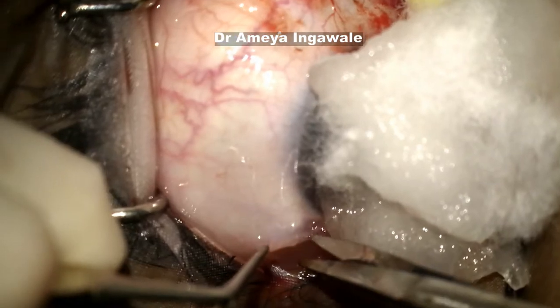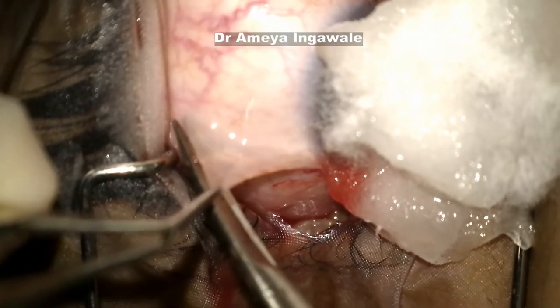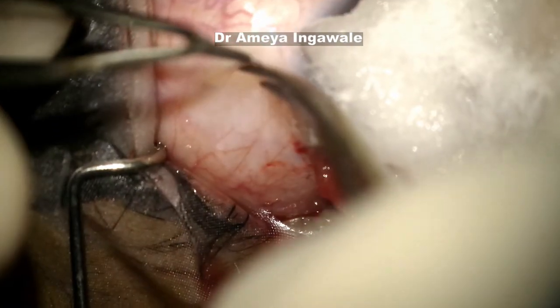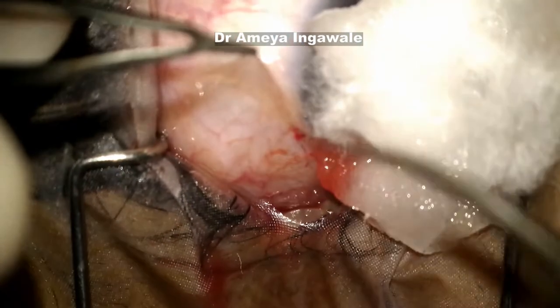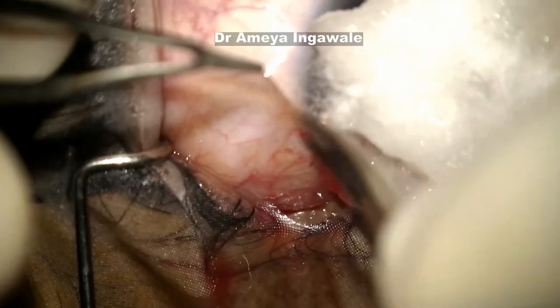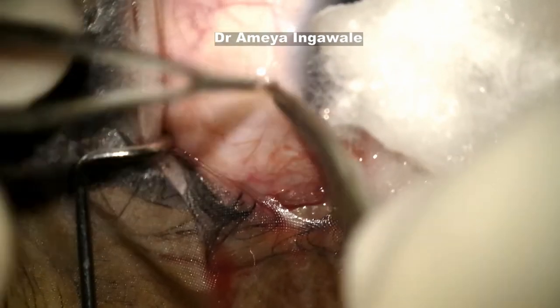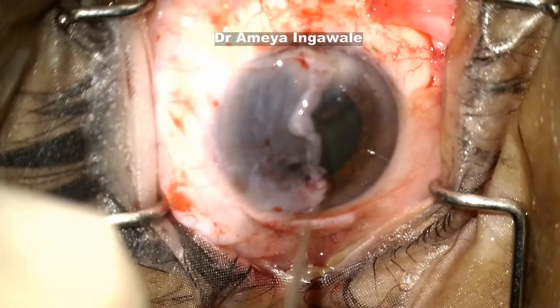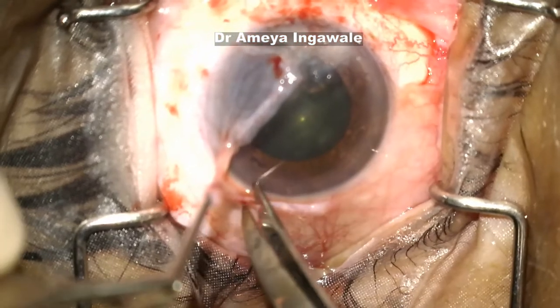Before making your graft, it's a good idea to insufflate the conjunctiva with some BSS. Make sure that the graft is Tenon's free — a very careful dissection. Keep lifting the graft and keep cutting with the scissors flush with the conjunctiva, so leave all the Tenon's behind and get just a very thin Tenon's-free graft. The thinner the better, as leaving fibers of Tenon's is not a good idea.